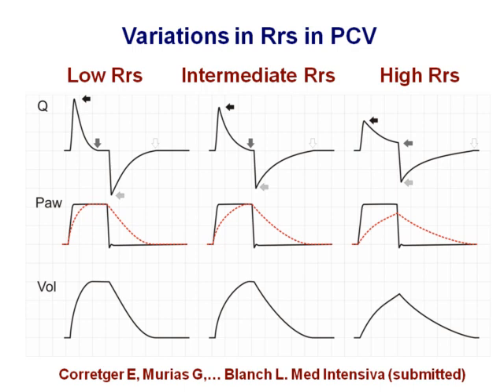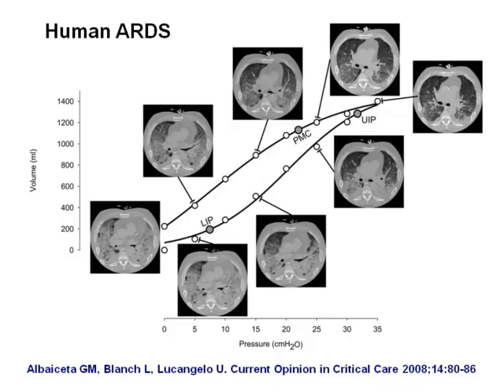But again, look at the flow tracing, the expiratory flow tracing, because maybe we get auto-PEEP and the initial peak expiratory flow is quite low compared to here. So to me, this is the most important thing. When we are at the bedside, look at those waveforms to decide what we are doing there.